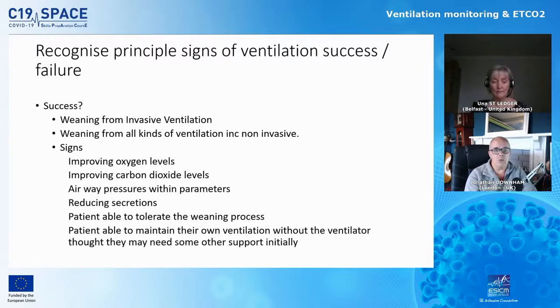How are we going to know that we are working towards success? So we look at several factors really when we're going through the weaning process with ventilation. So first of all, are their oxygen levels improving? So that's their saturations and their oxygen levels on their arterial blood gas.